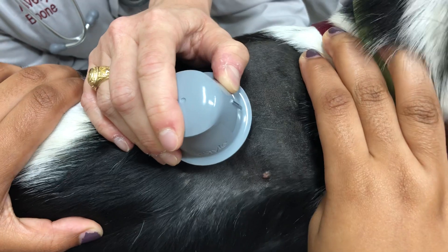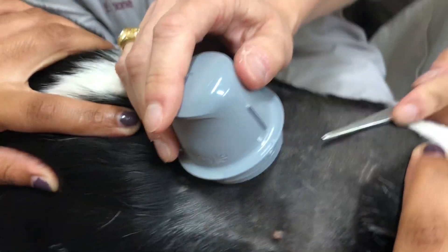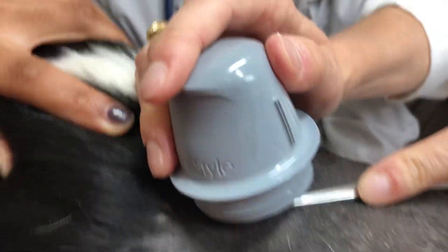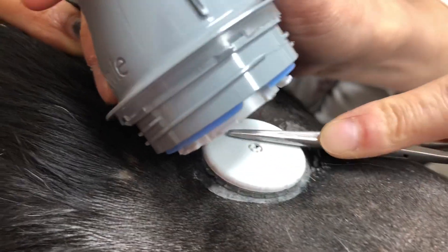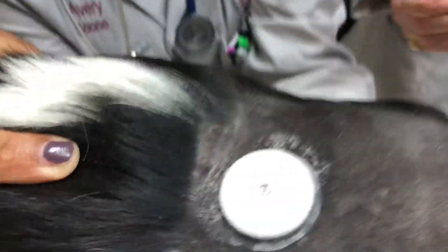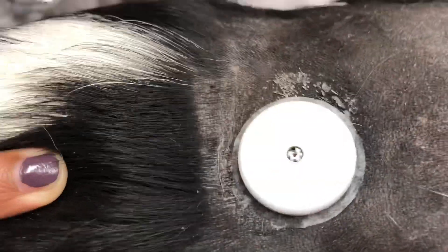Oh buddy! There we go — it actually popped right off. There we go, and that's it — it's gone from there now.